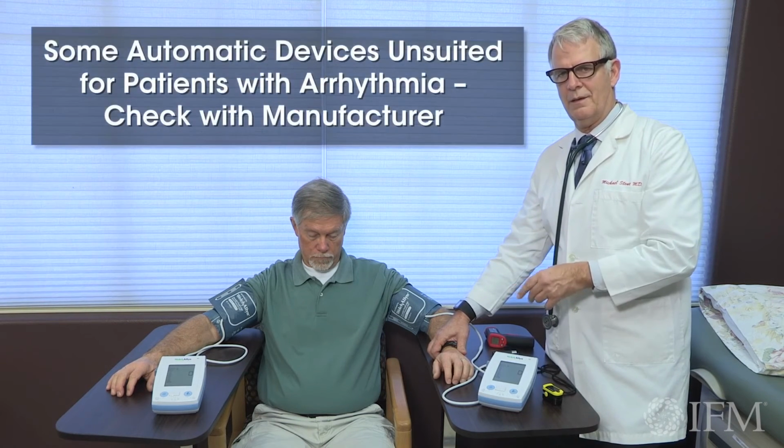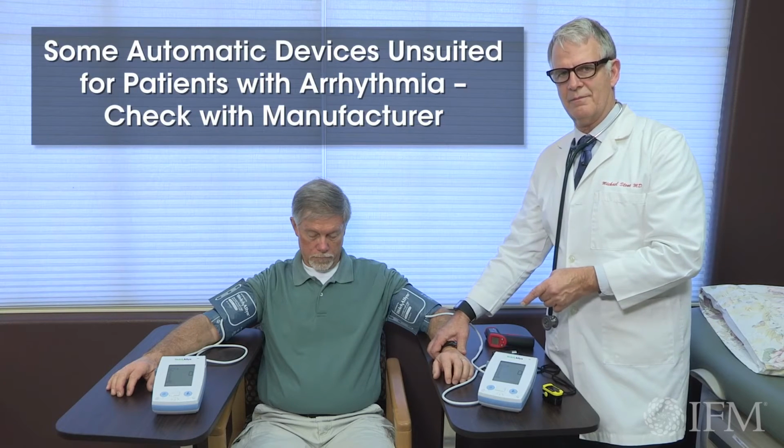So let's say you believe there is blood flow asymmetry, or you think there's autonomic imbalance. The next thing to do is simultaneous blood pressures. Now, the great thing with automatic cuffs now, as long as the patient does not have an arrhythmia, and you've checked that, then you can do simultaneous oscillating blood pressure determinations. Again, the patient could not have an arrhythmia to use the automatic cuffs.